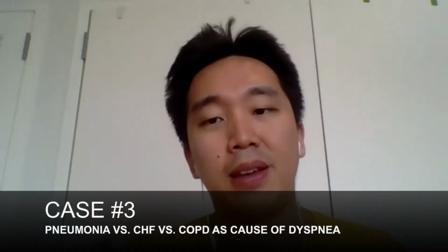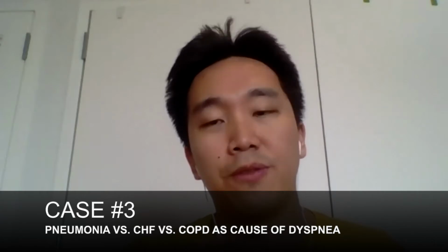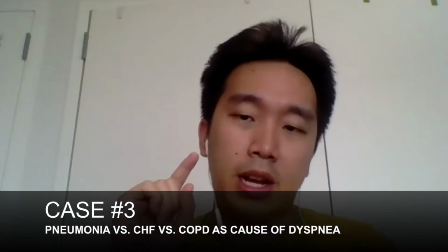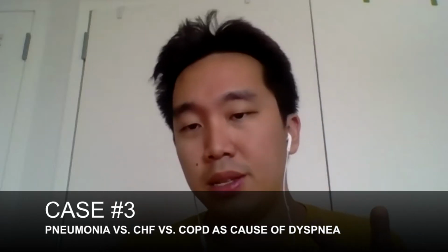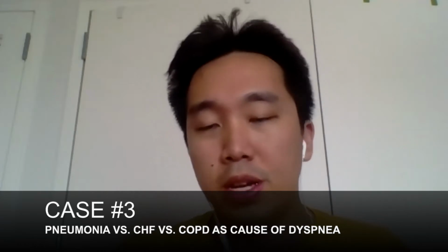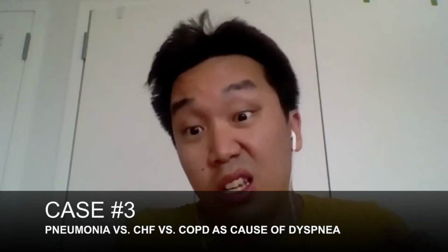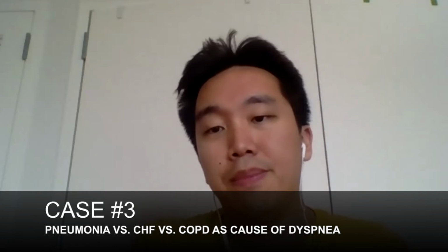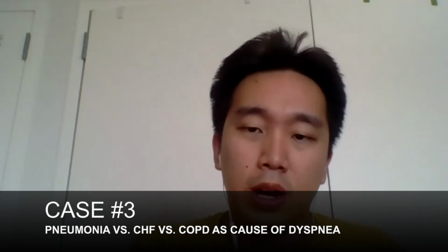And the last way I usually use ultrasound is for patients that have other comorbidities, like patients that come in with CHF, COPD, and also are short of breath and maybe have a fever. Those patients are very difficult to figure out what's necessarily causing their shortness of breath. The fever usually points towards pneumonia, but the CHF and COPD on top make it hard to figure out exactly what process is going on. And each of those patterns presents differently on your ultrasound. So that's the other area where I'm using the ultrasound a lot.